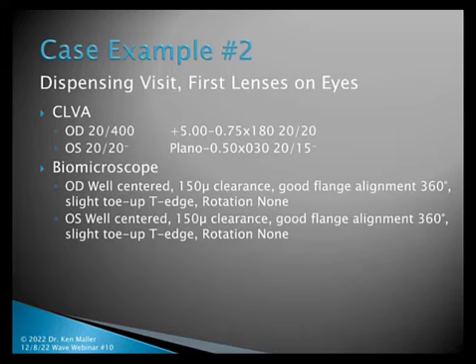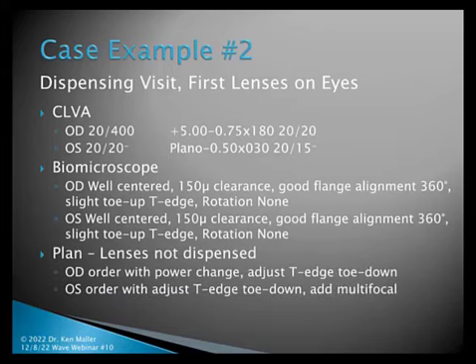I did not dispense these lenses given that the power was so far off on the right eye. And so on the right one, I ordered with the power changes, but I also adjusted that temporal edge to bring the toe down just a little bit. And on the left one, I was very, very happy with the fit, just that little bit of temporal edge issue. So I decided to go ahead and add a multifocal since I was already very, very close with the fit and the prescription.